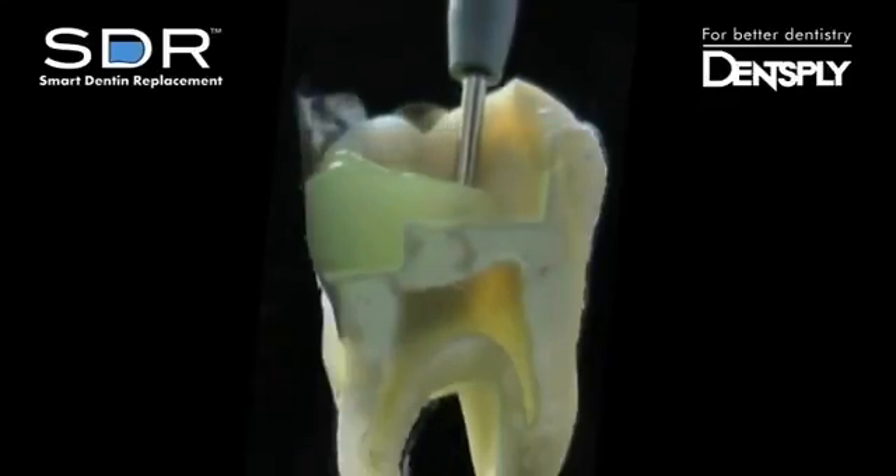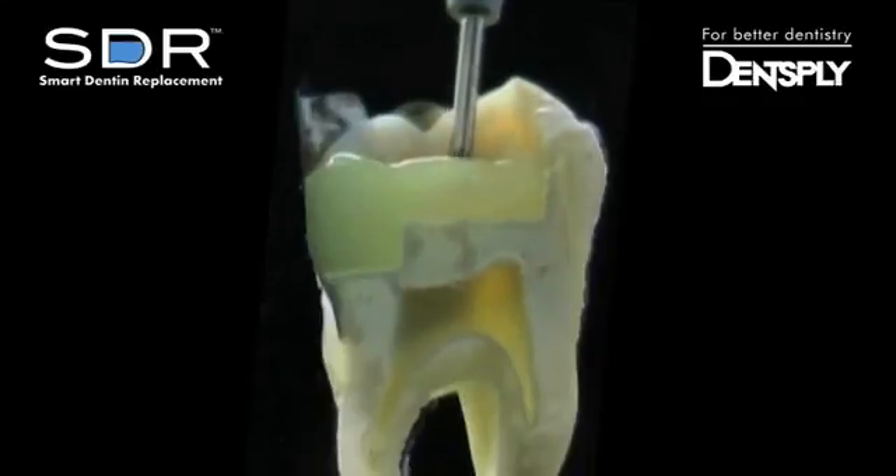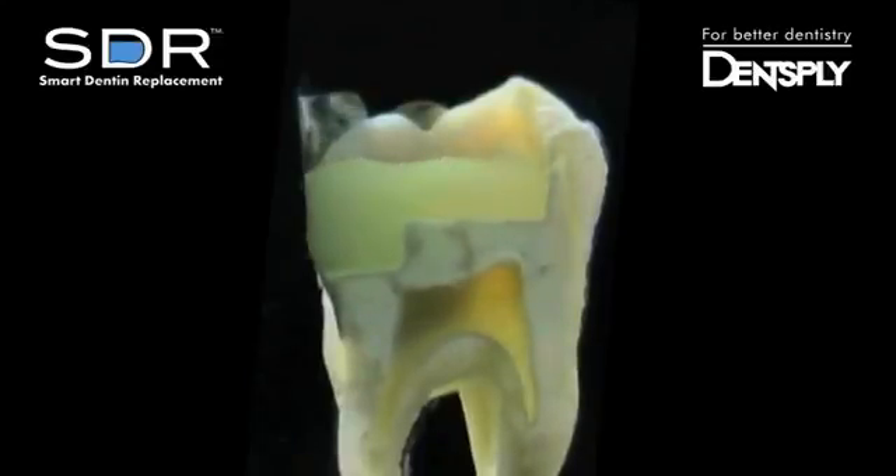As we move across the prep, the material is not pulling or dragging, but moving along with the cannula tip. After placing the material up to 4 millimeters, it quickly levels to provide a smooth interface to adapt composite to.